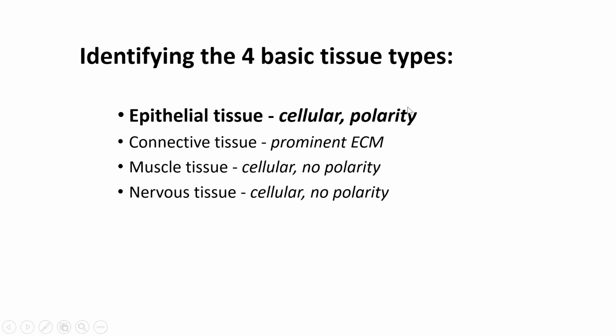So before each of our tissues, I'm going to highlight the tissue that I'm going to talk about. So we're going to talk about epithelial tissue. And one of the things I want to point out is that it's very cellular and it has polarity. And we'll define what that is here in just a minute.